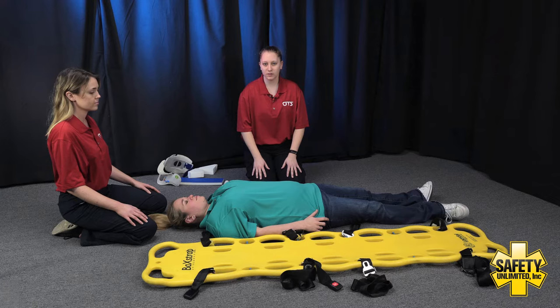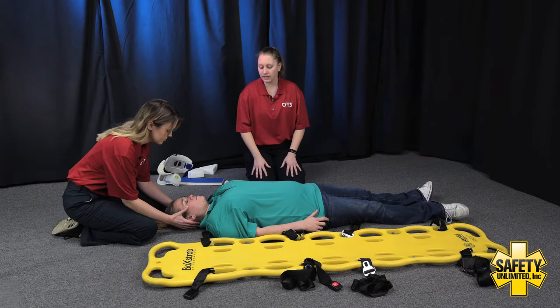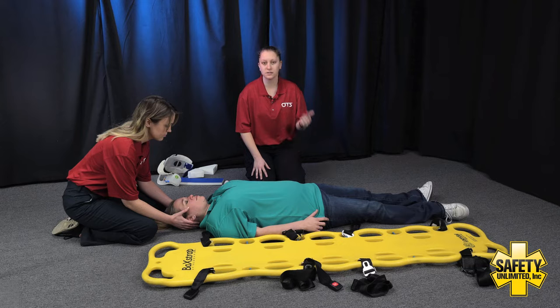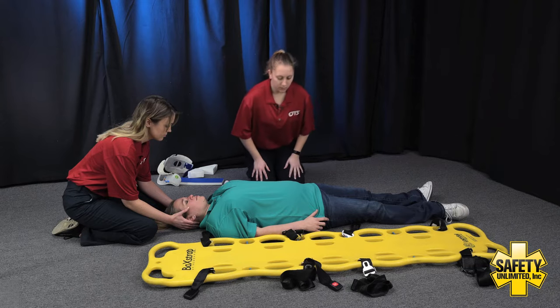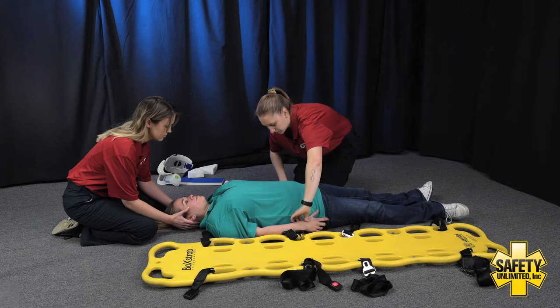First thing I'm going to do is direct the EMT assistant to hold manual stabilization of the patient's head and neck, keeping it in a good neutral inline position. Next we're going to check CSM in all four extremities — that's circulation, sensation, and motor function. First I'm going to check for those radial pulses. Present and equal bilaterally.